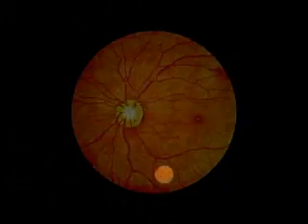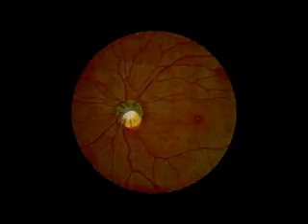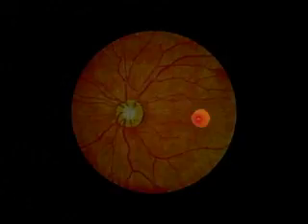Examine the surrounding retina for hemorrhages or exudates, noting their size, shape, color, and distribution. Again, there should be none. Finally, examine the fovea and surrounding macula by directing your light beam laterally or asking the patient to look directly into the light. The tiny bright reflection at the center of the fovea may help orient you.